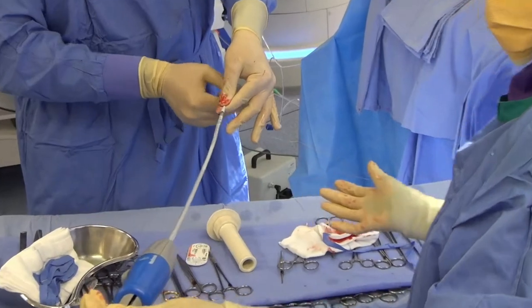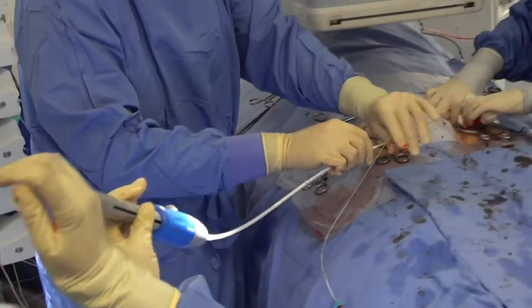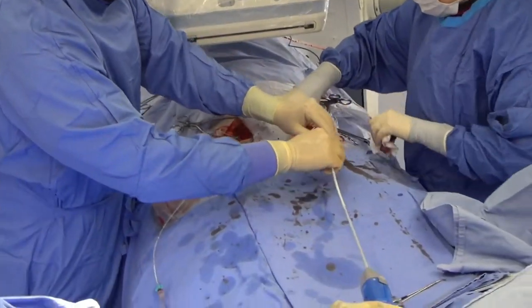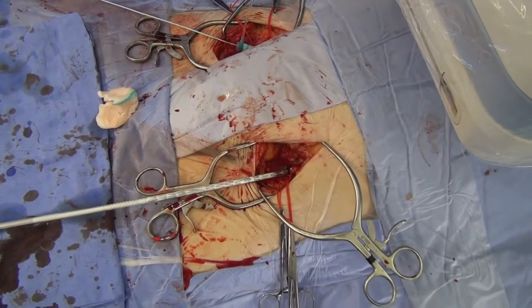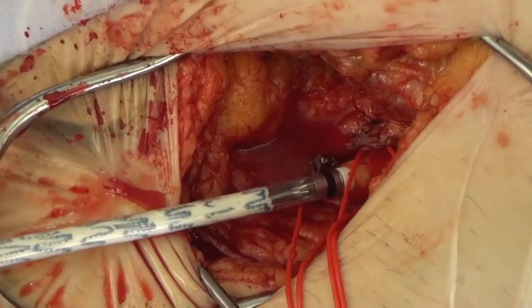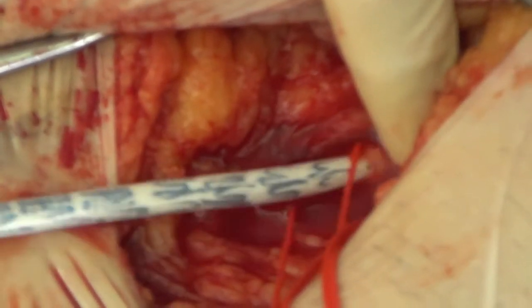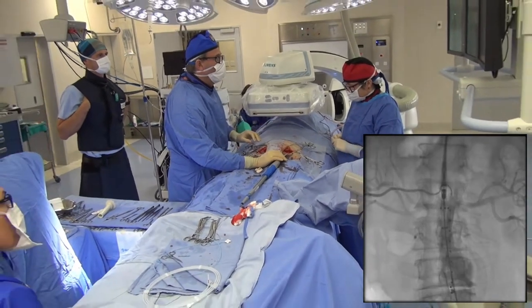The main body of the stent prosthesis delivery system is passed over the stiff guide wire, through the femoral artery, and further advanced into the abdominal aorta. Exceptional care is taken not to injure the femoral artery. The correct proximal position of the main body is determined by injecting contrast through the pigtail catheter and assessing the level of the renal arteries. The position can be adjusted at this point to avoid occluding the renal arteries.